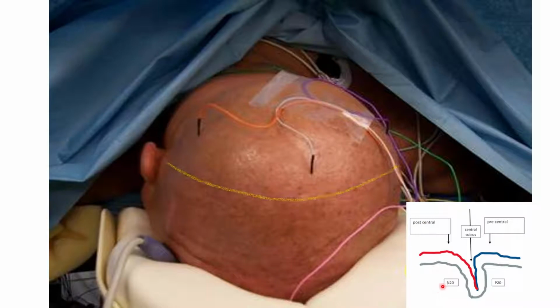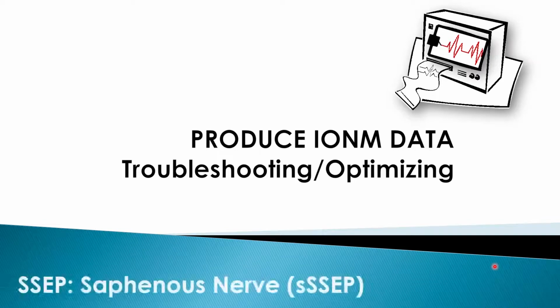Your N20 response will be maximal anywhere between C3 to CP3 or C4 to CP4. If you're too far anterior, you're going to either get a bifurcated wave or, like I said, even an inverted cortical wave. Let's talk about saphenous nerve SSEP.